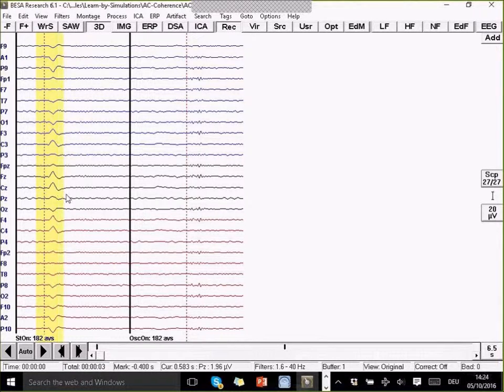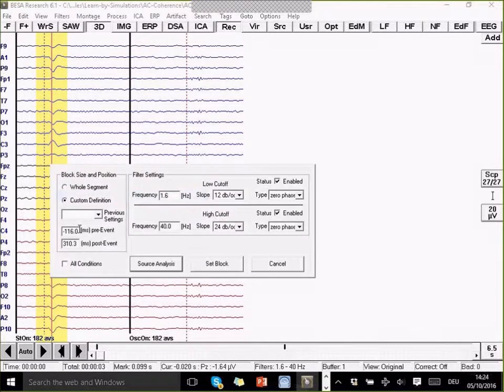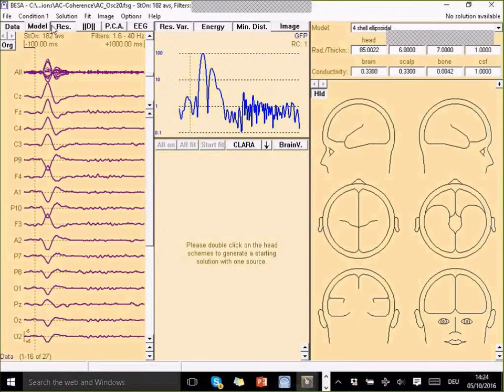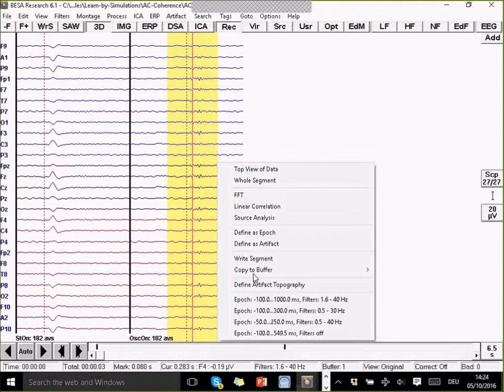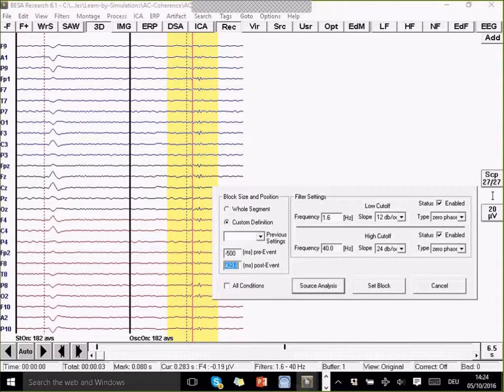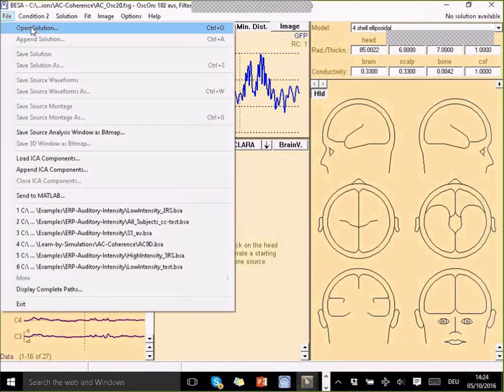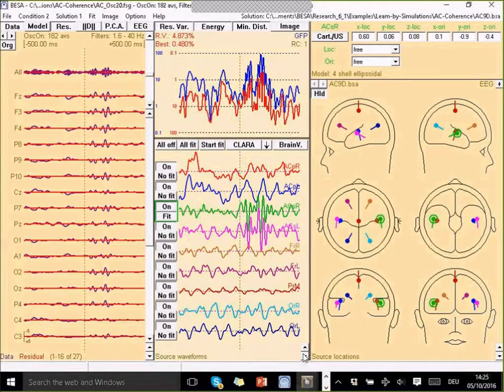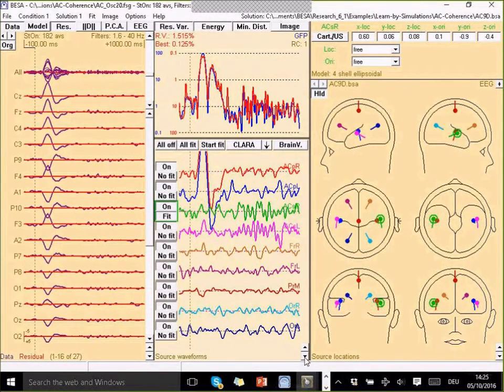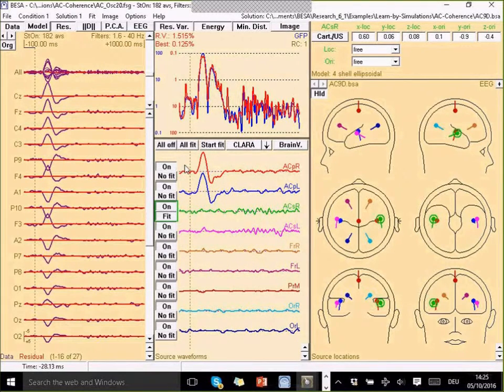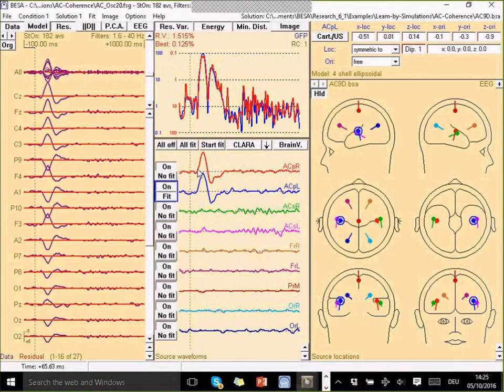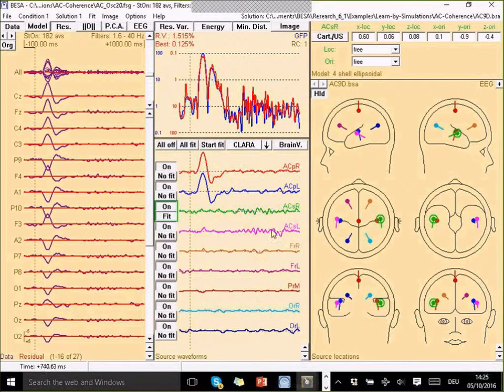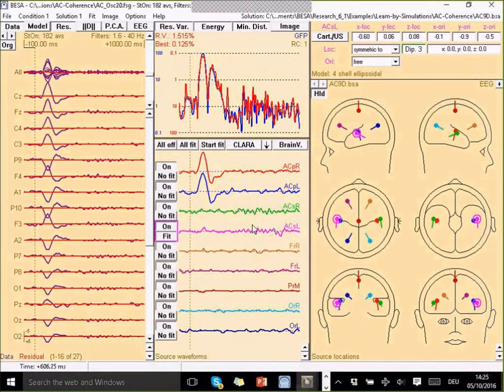If I look at this in source analysis and bring up this one and also the other epoch, I can now load a solution that was created for this. These first four sources, let's go back. This is the condition where we averaged the first stimulus. You can see the first two sources here, they show the response according to the stimulus. Then we've got the next two sources which should show the oscillatory response later on, but they are very much averaged out.